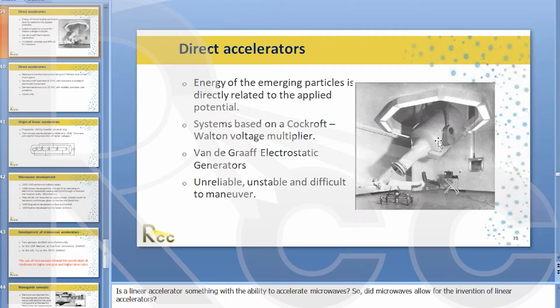Cobalt gave some skin sparing, and Cobalt, because of the energy, if you look at stopping power ratios, I don't want to get too into the physics here, but if you start looking at stopping power ratio for the different tissue types, you see that as you approach higher and higher energies, instead of the photoelectric effect, you have the Compton effect. The Compton effect ends up treating all of the tissues as about the same density, not a big change in tissue density with using higher energies, more so with lower energies.